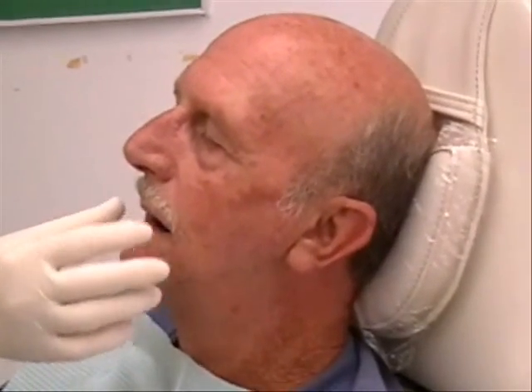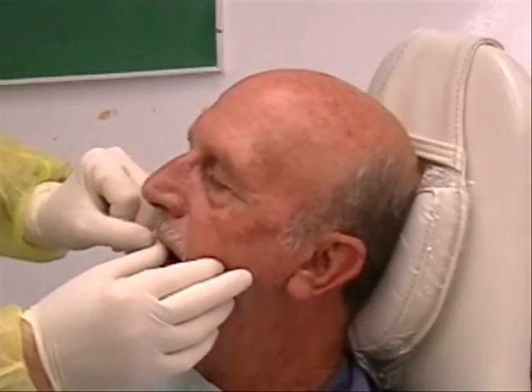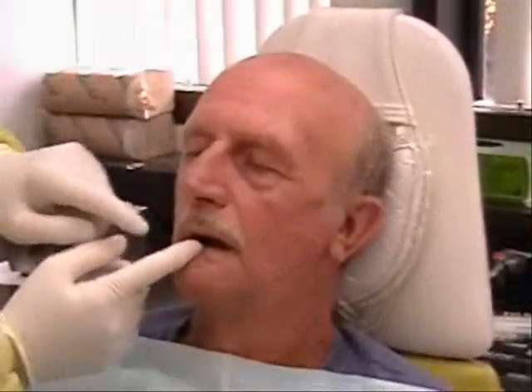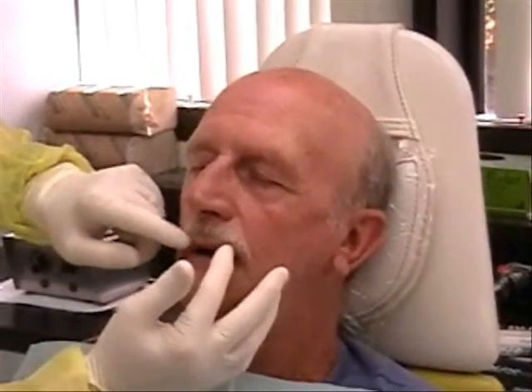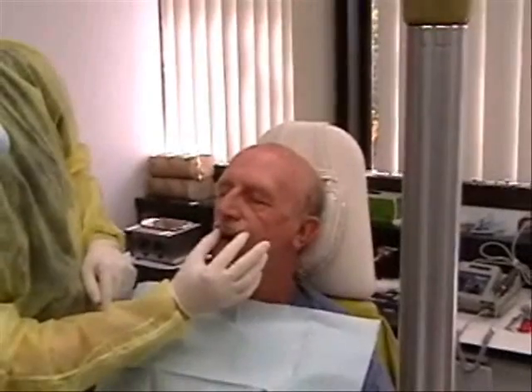I want you just to relax your lip. Look for the upper lip. He's right at about half a millimeter below his lip line. You could argue making it longer, but given his age and everything, I think that's probably a good — got good lip support. We could actually see some of the upper lip. It's not too puffy or anything. It looks good.